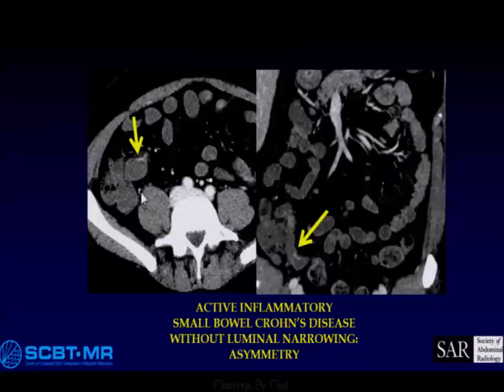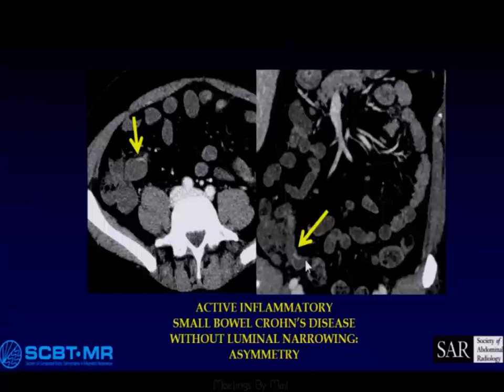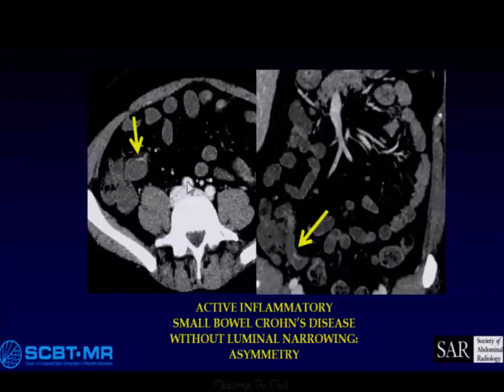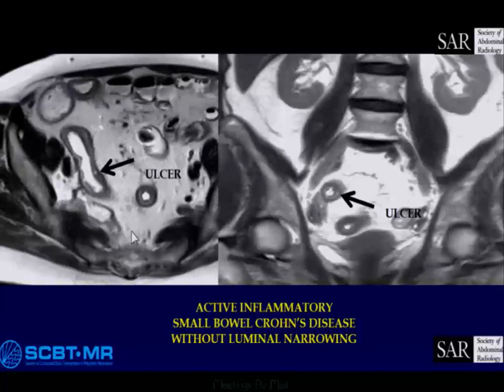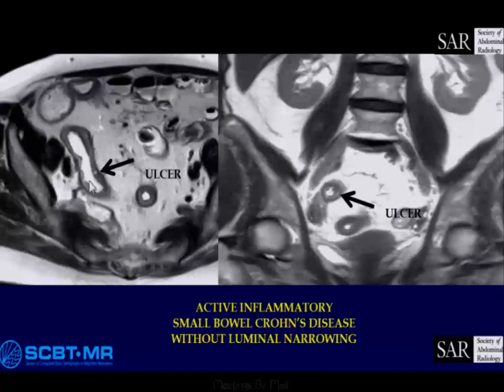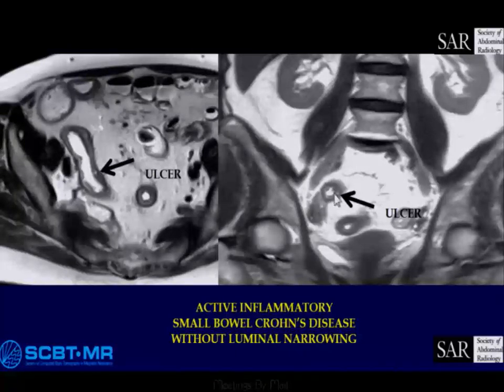Here is an example of asymmetric change. We can see it along the mesenteric border, not along the anti-mesenteric border — a little bit of wall thickening, a little bit of hyperenhancement. Here we are in MR: T2 bright, and there's actually an ulcer. Notice the asymmetry — more ulceration on one side than the other. And here it is again with a little ulcer on each side.